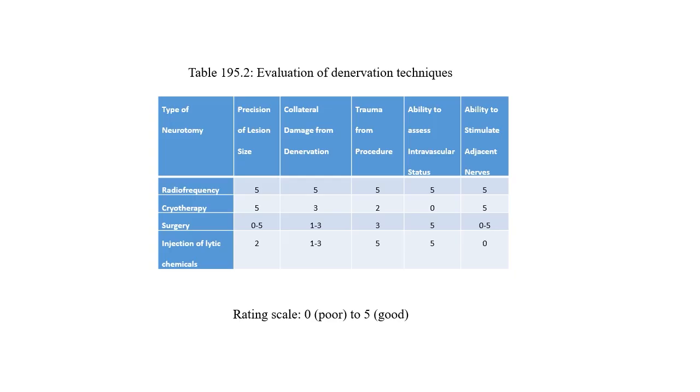This increases safety by stimulating adjacent structures with a harmless electrical field prior to denervation, decreasing the potential for motor and sensory deficits. While classically described in the lumbar space, radiofrequency denervation of cervical medial branches for the treatment of head and neck pain have better evidence for efficacy and are frequently done. The medial branches of 2 segmental spinal nerves innervate each facet joint ipsilaterally, and therefore both of these 2 branches must be ablated per spinal level to denervate the joint.